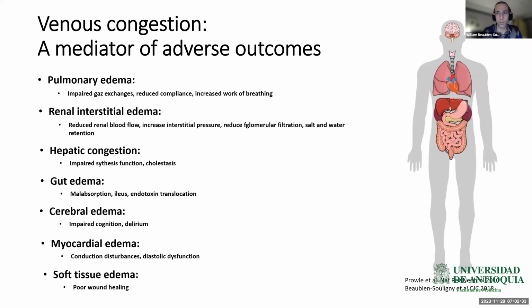In terms of post-op complications, pre-op femoral pulsatility was associated with a higher proportion of AKI and major complications. For duration of post-op support, pulsatile femoral flow pre-op had longer durations of mechanical ventilation, vasopressor requirements, ICU stay, hospital stay, and a composite of post-op support duration called the T-pod. And finally, on multivariate analysis, the association between femoral pulsatility and the T-pod remained statistically significant when adjusted for pre-op risk factors.